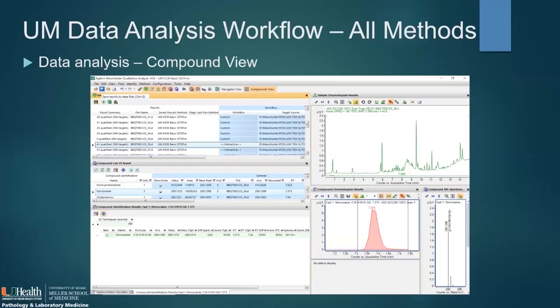So we say the scores have to be 70 or above, and then we say the ppm needs to be plus or minus 10 for us to report. We do, for our kind of thresholds for these, allow a little bit of leeway. We might say populate anything with a score of 60 and with a ppm of plus or minus 20, so that we can just take a look just in case there's a compound that's overloaded and maybe that threw out the ppm. However, we won't report those. But this is also where we can delete those poor matches from a data file and from reports.